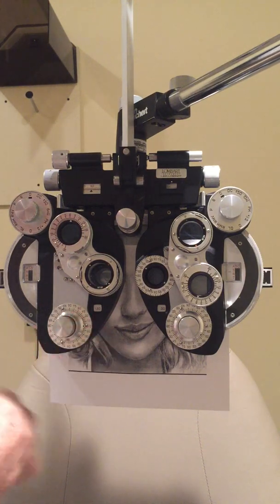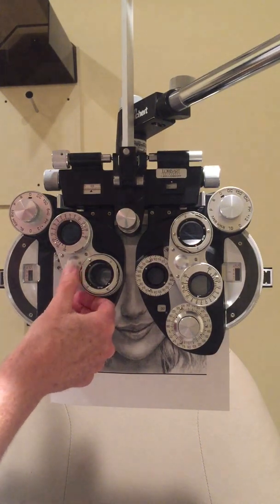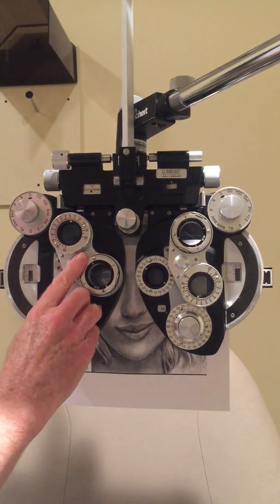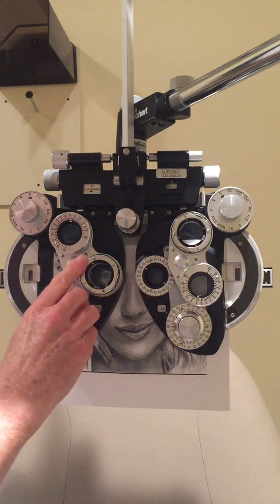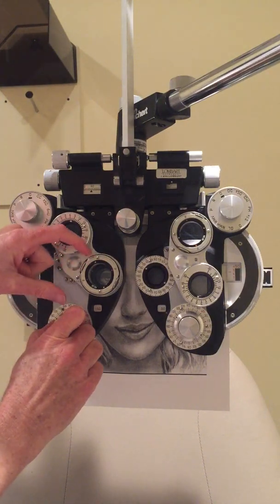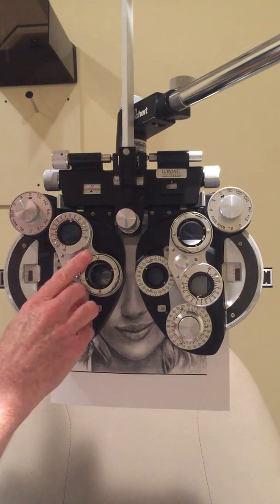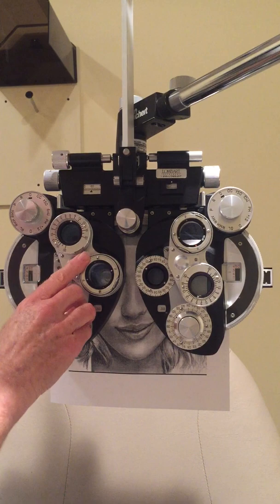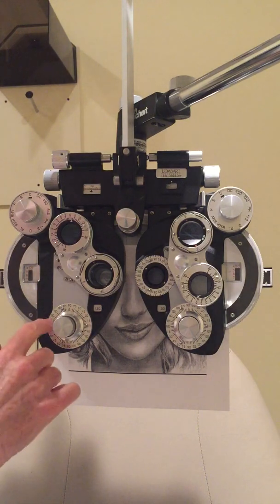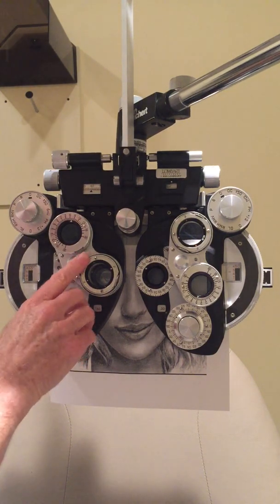I give her plenty of time to decide, with a nice rhythm so she knows she can ask again if unsure. She prefers position two, so I rotate the axis about 15 degrees. She continues to prefer one direction, so I chase the white dot — moving the axis in the direction of the white dot, which is what you do in a plus-cylinder phoropter. She then brings me back, so I go back, but not quite as far as before.